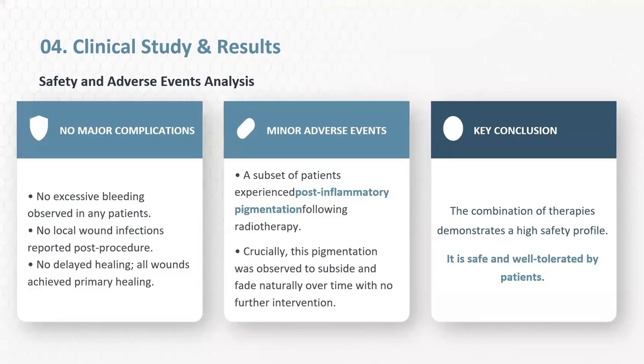Importantly, the treatment was very safe. We observed no major complications like excessive bleeding or infection. The wounds healed well.